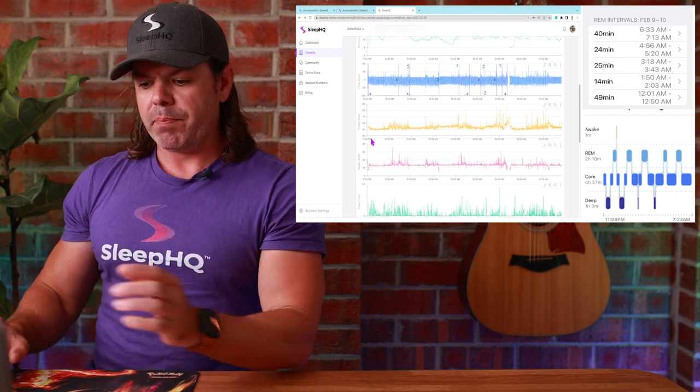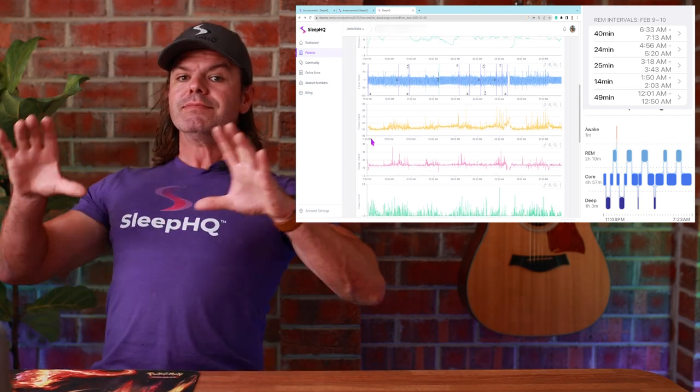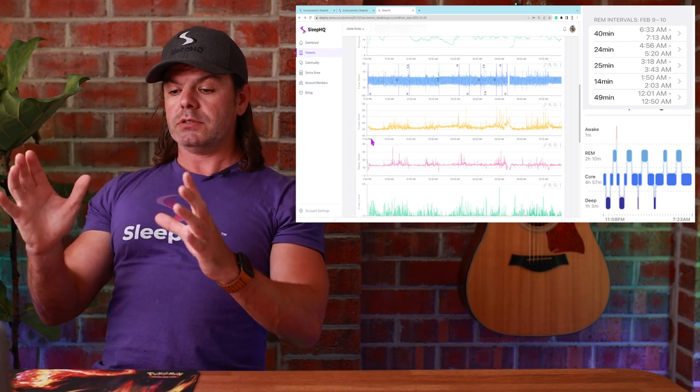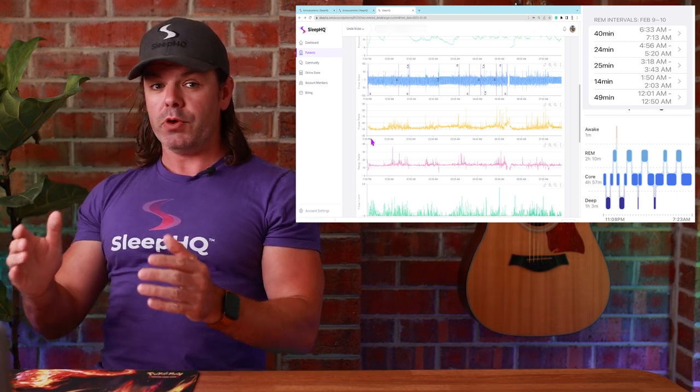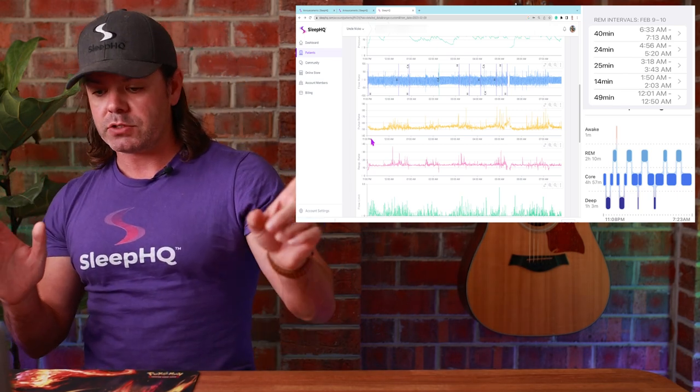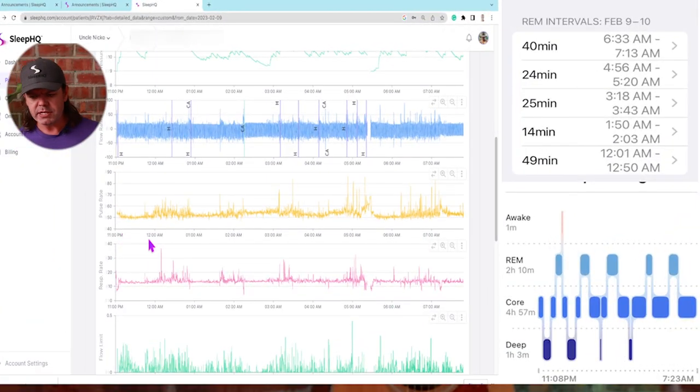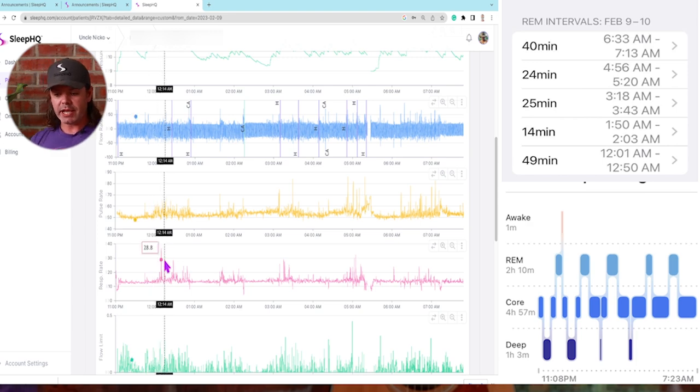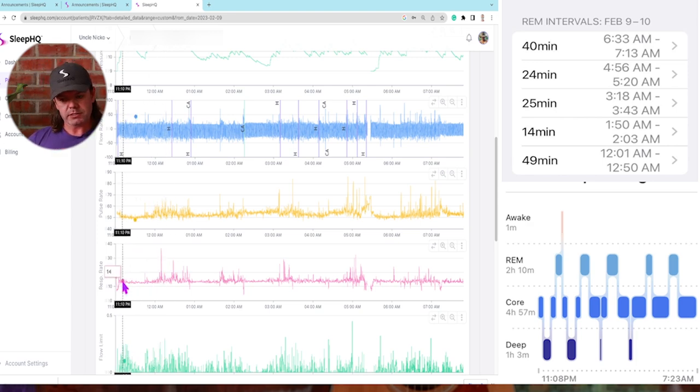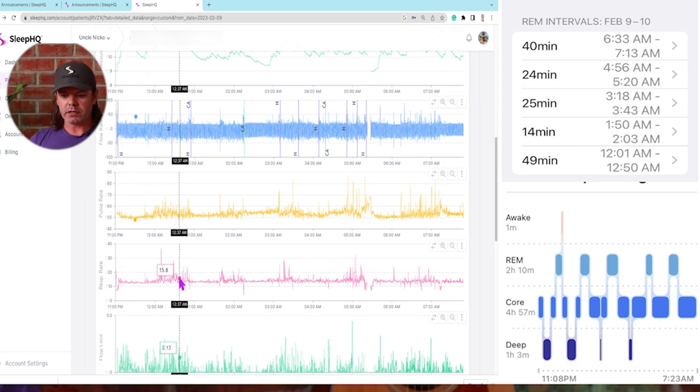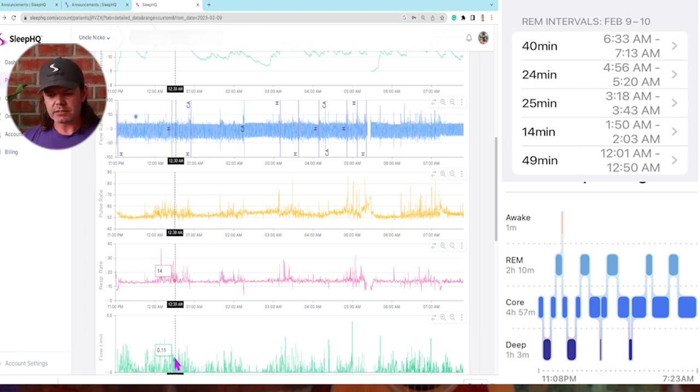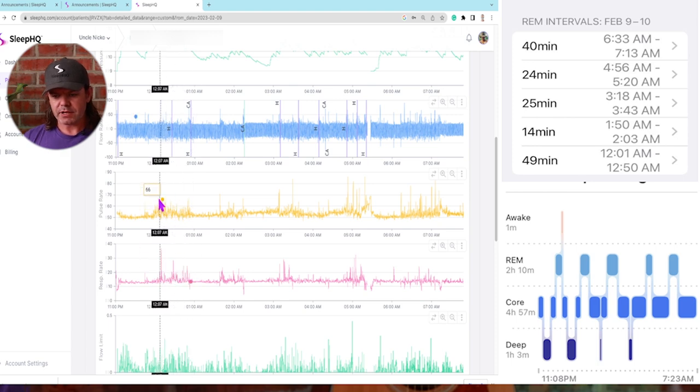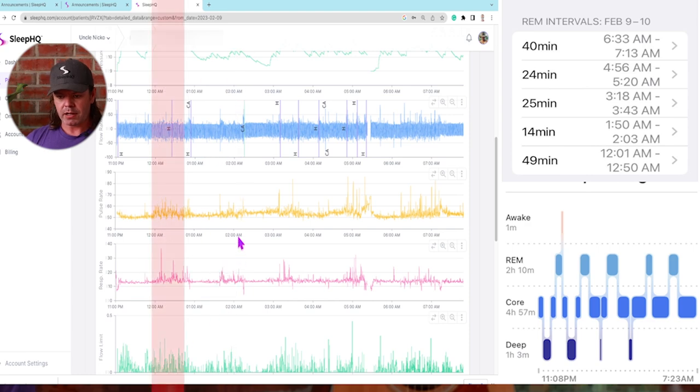Now, straight off the bat, if we just sort of step back and take a look, we can see a few patterns emerging without even checking out those timestamps, especially in relation to the pulse rate, the respiratory rate, and the flow limitation. Look, I can see it here with the pulse, with the respiratory rate, nice and flat. And then all of a sudden, you get these periods of instability. See here, all of a sudden it's becoming erratic, irregular. There's one period here.